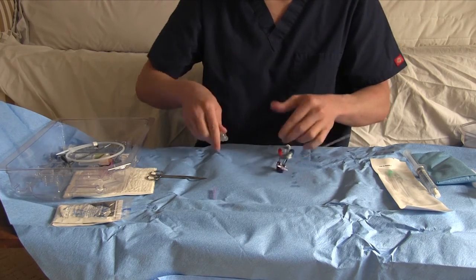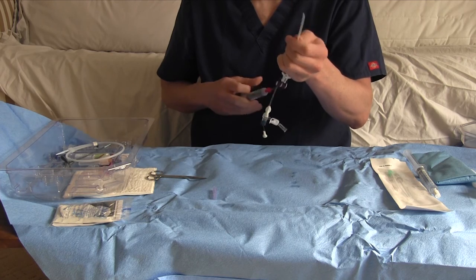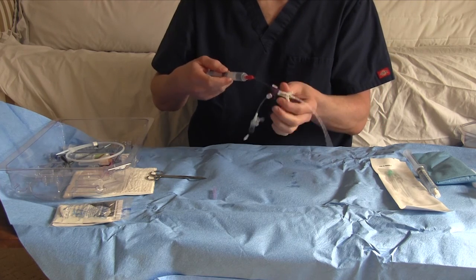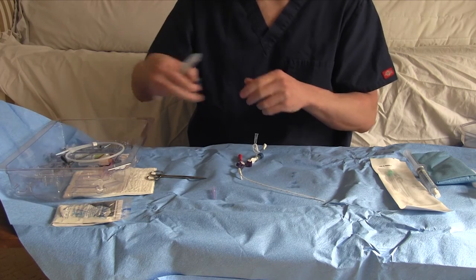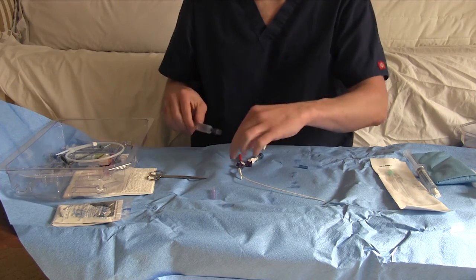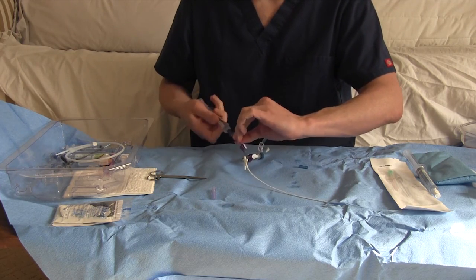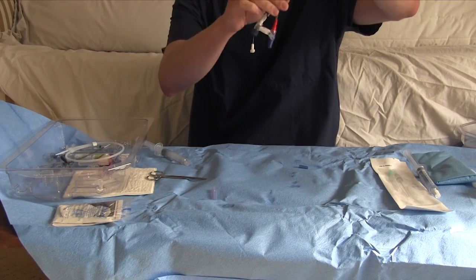And then the other one just gets directly flushed. And I'll lock that one too. And if you want, on the red one you could put on the blue cap right now after flushing that. All right, so there we go. This is our midline set up, ready to go.